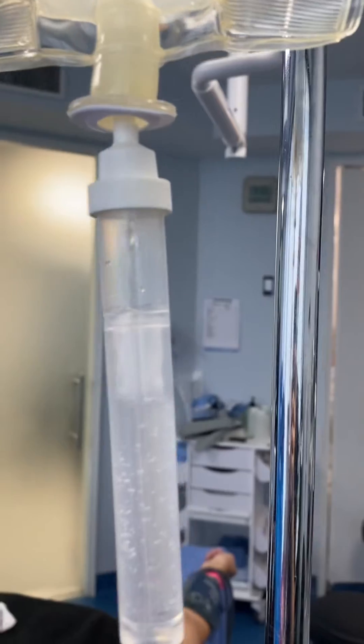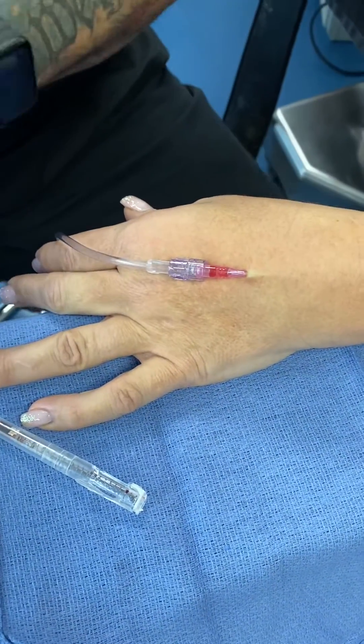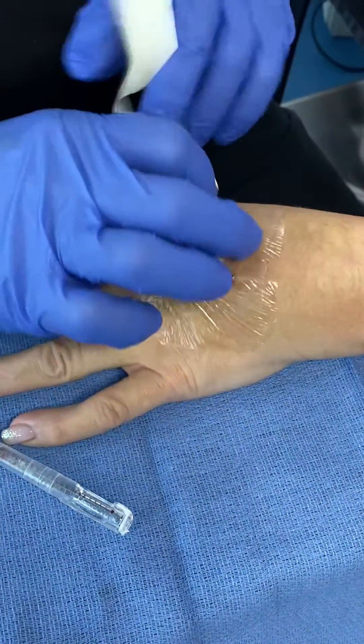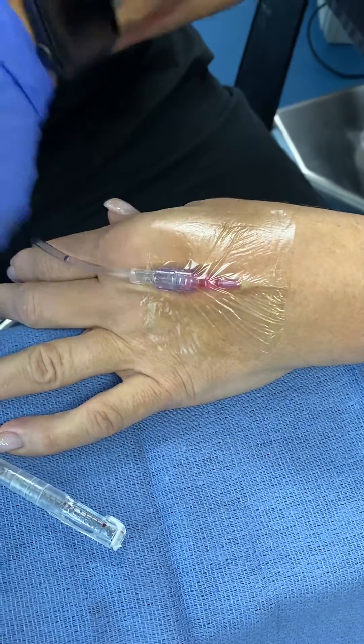Now make sure I have blood flow or IV fluid flow — you want to show that up there real quick? It's going nicely into there. We're looking to make sure that there's no extravasation of IV fluid. I just started doing this technique where I'm using two tegaderms, and it really secures it really, really nicely. If you guys want to use this technique, feel free to do it.